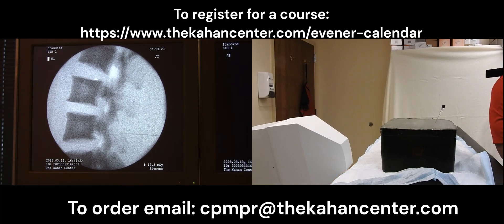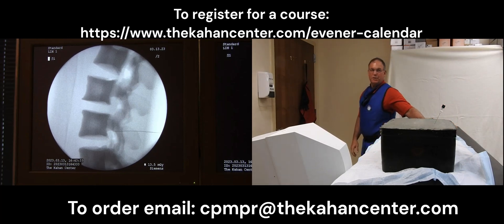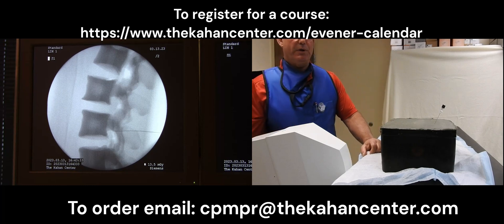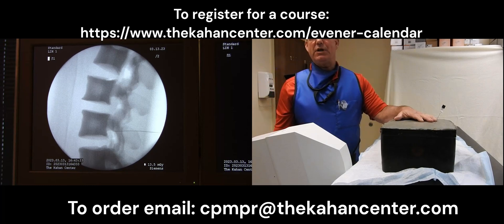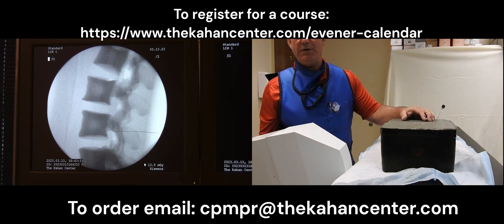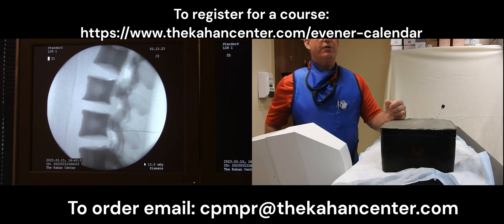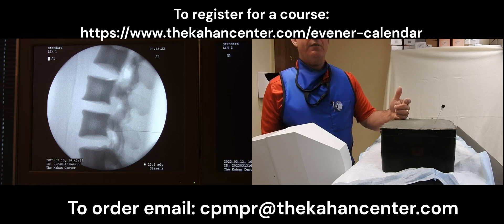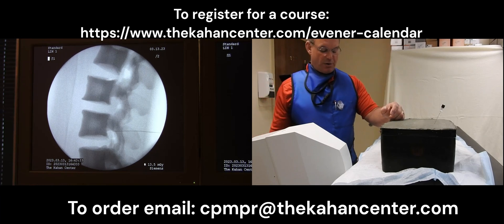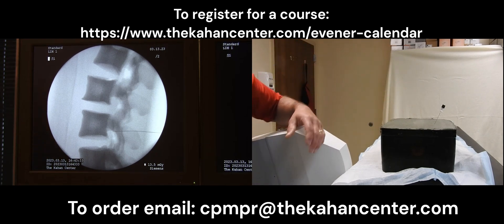At this current time, once we have our lateral view completely lateral, I would again confirm the proper position and inject dye as we're doing it with a regular patient. I would not inject dye utilizing Stick It To Me because dye does not wash out — it doesn't wash out in patients, doesn't wash out in models, doesn't wash out in cadavers. But this would be a successful transforaminal epidural injection utilizing Stick It To Me, so that you can practice in your own office over and over again, train residents in your own office, and run any type of educational program that you would like utilizing Stick It To Me.